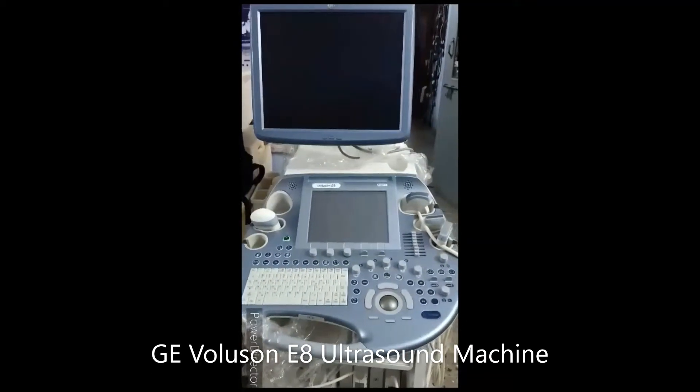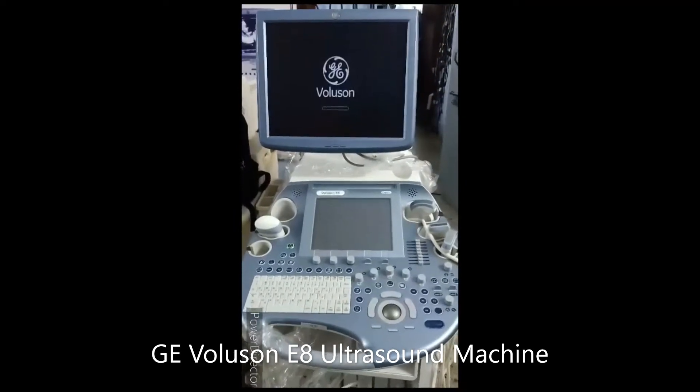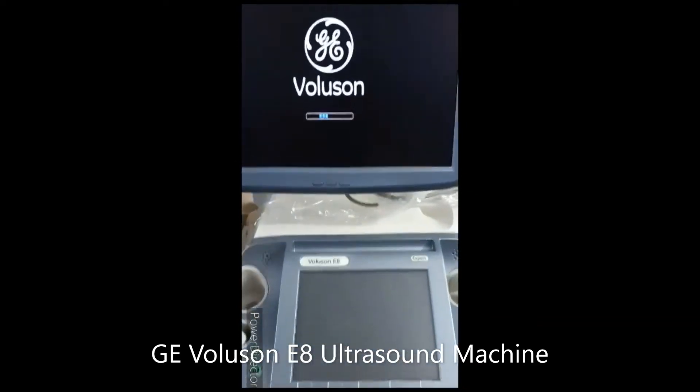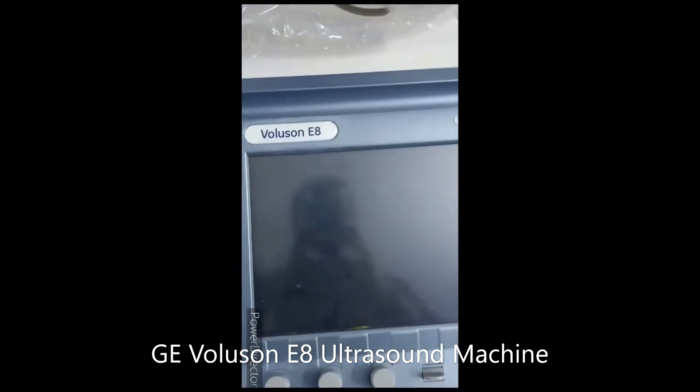Hello, today we are looking at the Wallyzone E8 Expert ultrasound machine. I just found the machine. You can see in the display the GE logo is coming up — the machine right now is booting up, the Wallyzone E8 Expert.